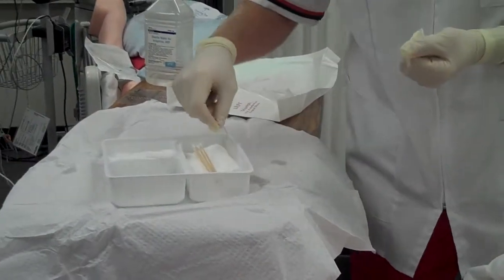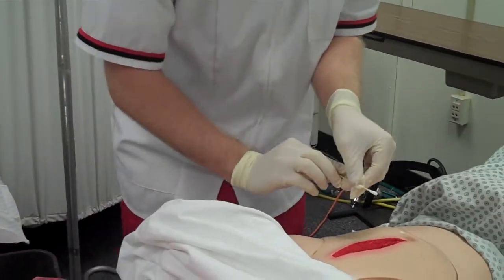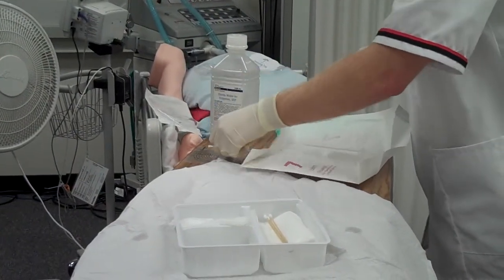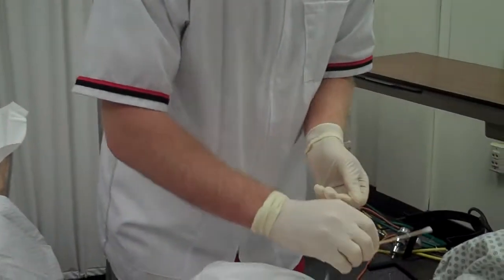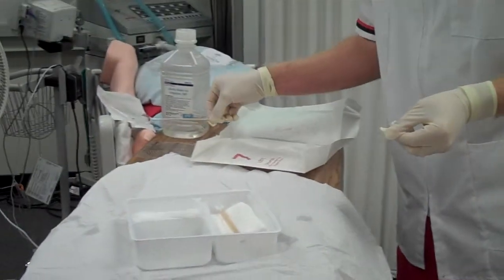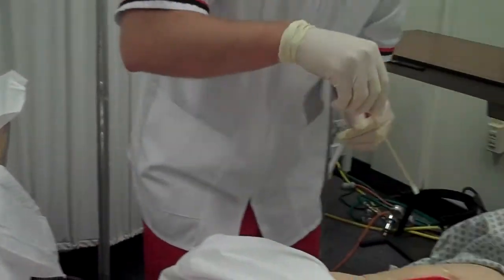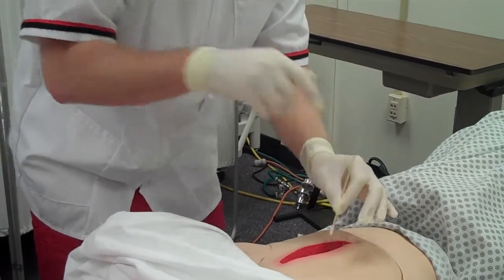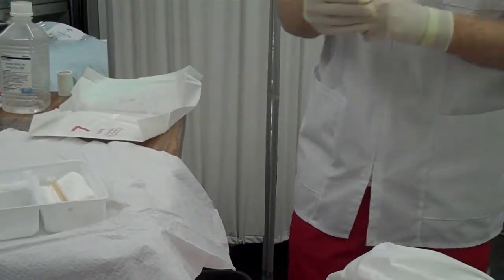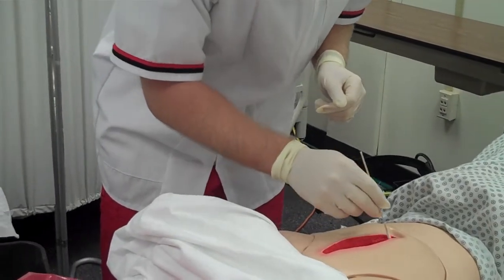And what I'm going to do now is measure the width, and then I'll put it on my ruler right here. Then I'll measure the length. And I'm going to measure the depth after I wet it, the end of it. And then I will measure that on my ruler and dispose of that. Next, what I will do is assess for any tunneling present, and there is none.